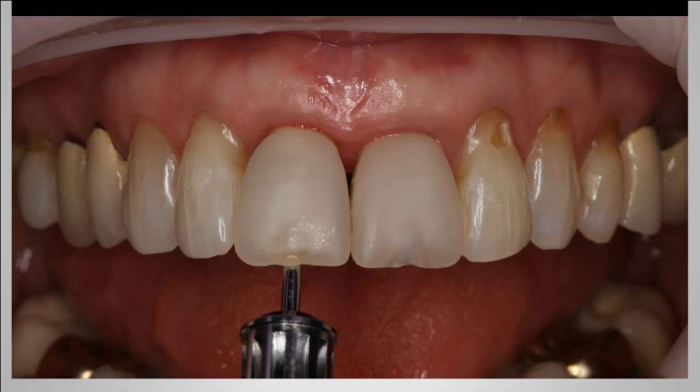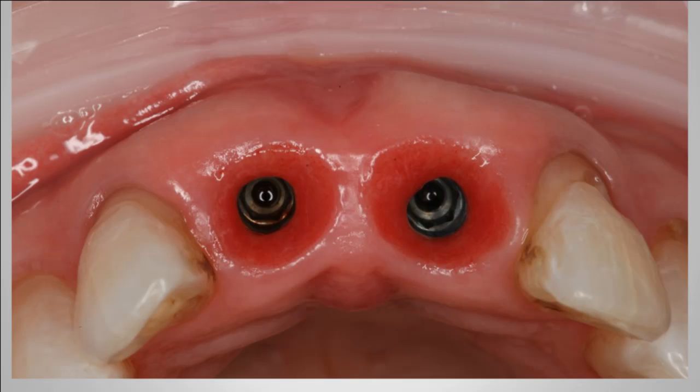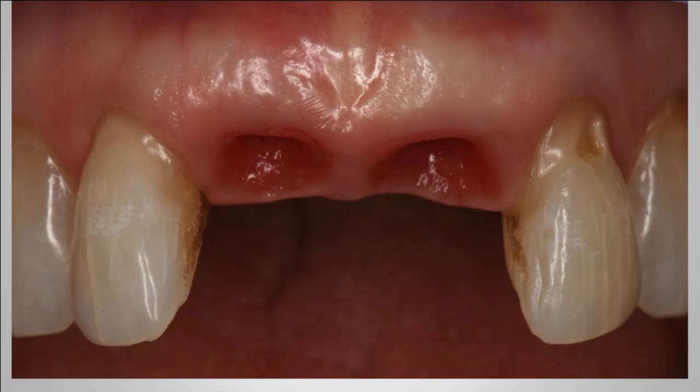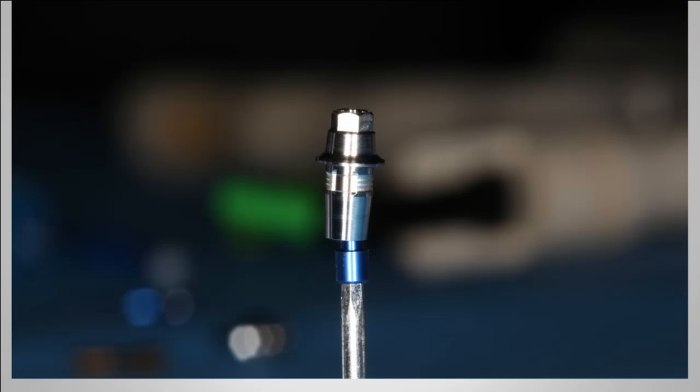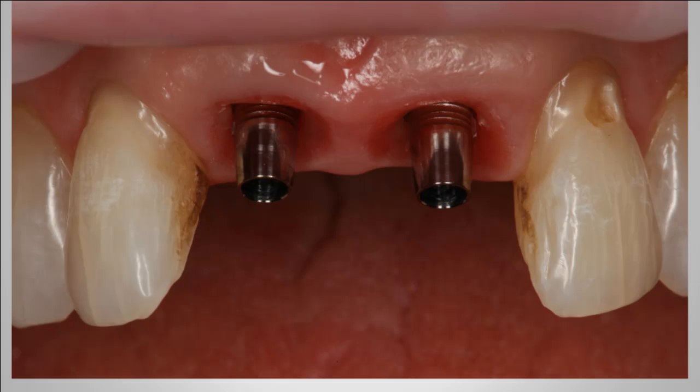Now in the next image, you'll see that we can remove our 2 screw-retained provisionals and see the quality of the tissue that we've created through our prosthetic provisionals. Instead of using the scan posts, we seated the tie bases because we had clear access to understand where this notch was located. So you can see that the tie base is used in this case as opposed to the scan post. The tie base is seated directly to the implant, as you see here.